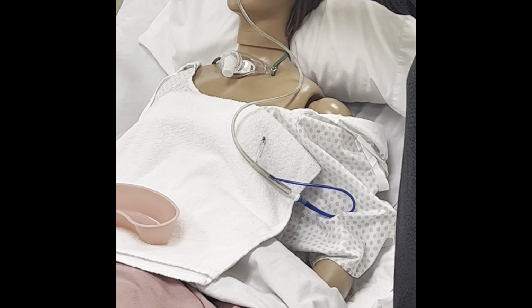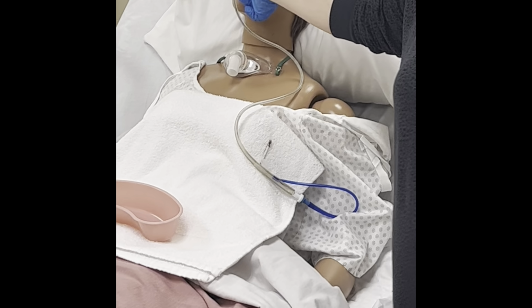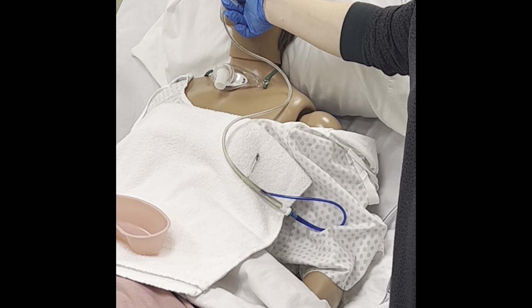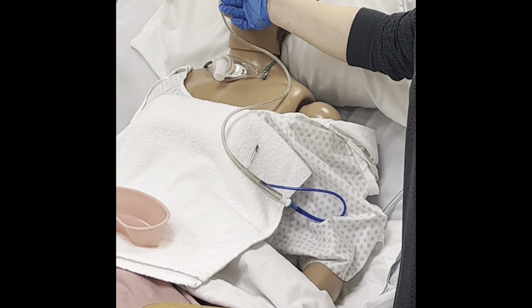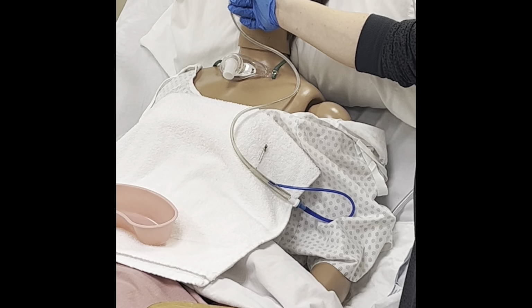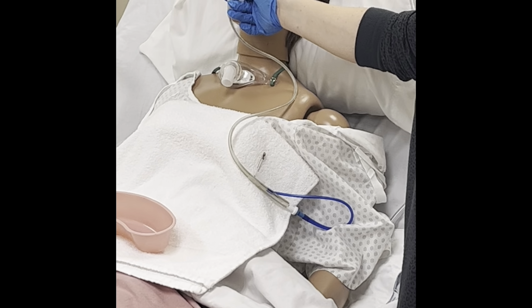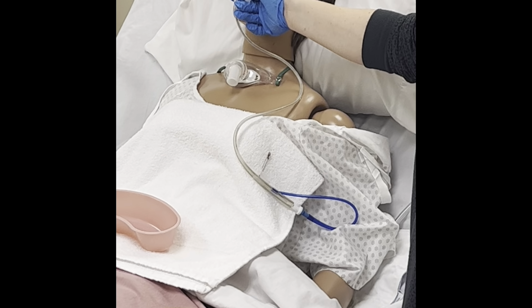We're going to take the tape off the nose. Still want to hold on to it because it could slide out. Then we're going to tell our patient to take a deep breath and hold it. They have to hold it this time. Again, we don't want them to aspirate any of that stomach contents that could be on that tube. It tells you to pull the tube out gently, wrapping it end over end and avoiding splashing.